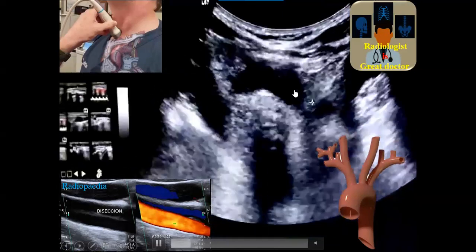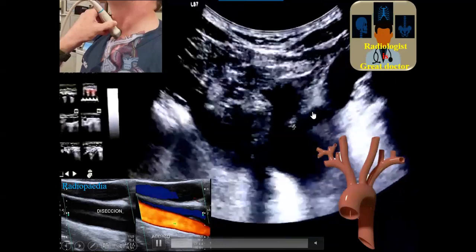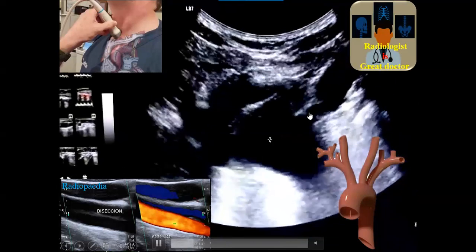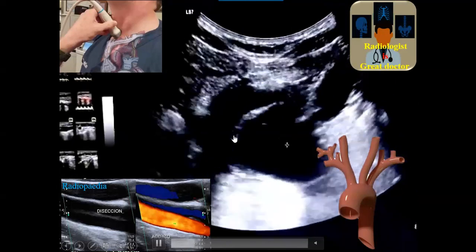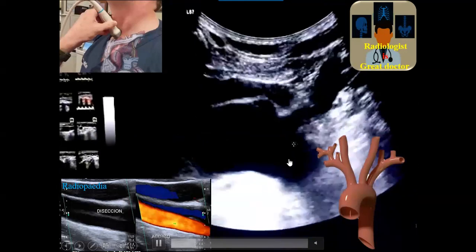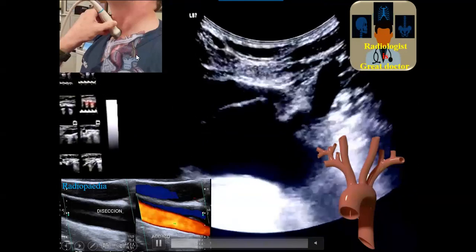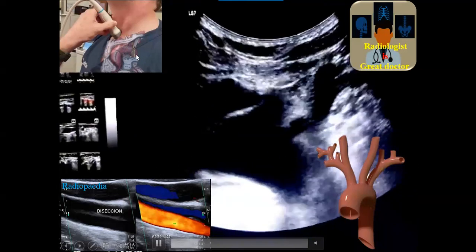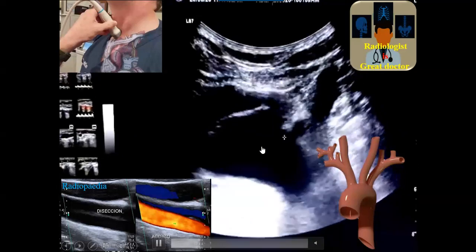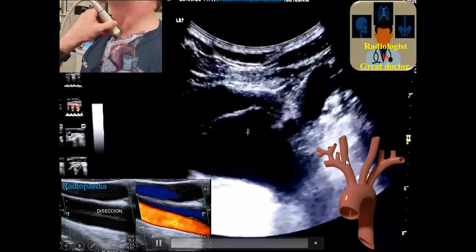While on the opposite side, the left common carotid is seen as well. So this is the brachiocephalic or innominate artery, and this is the left carotid. By directing the transducer downwards, you will see these two main branches using this simple approach.